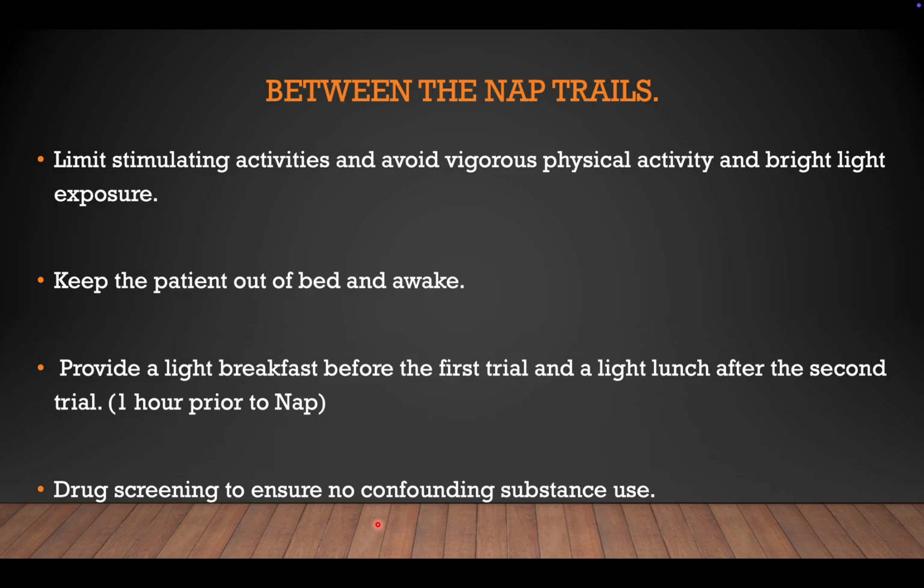Keep the patient out of the bed and awake. Sometimes it may be very difficult to keep the patient awake, especially because the patient is excessively sleepy. So you may need to find a way, or be with the patient and keep the patient awake.